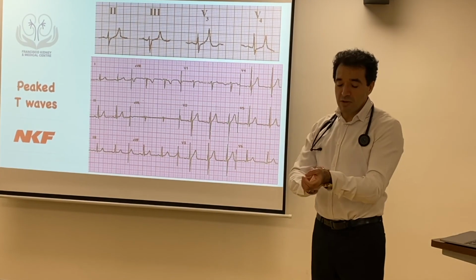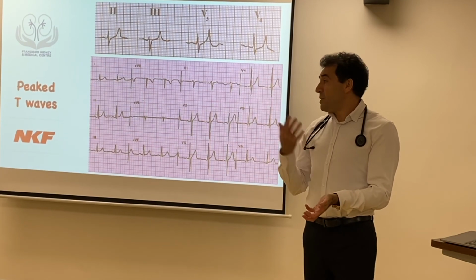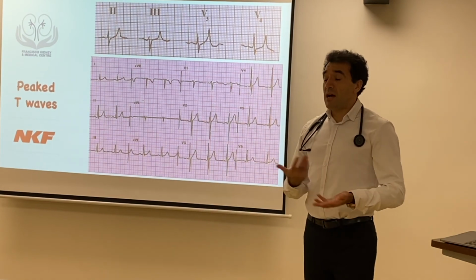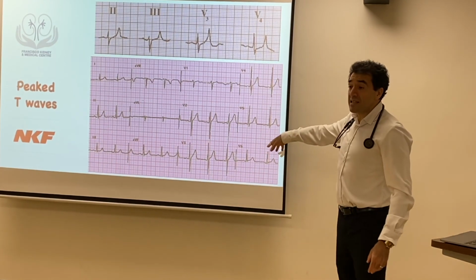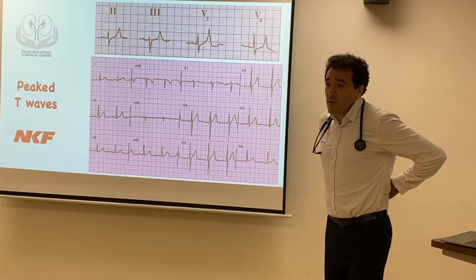So it's like you can measure also the pulse here. And then you can see there are always going to be variations. In a patient that probably has an arrhythmia, the variation can be from 5 minutes to 5 minutes earlier, could be maybe a different rate and different things, no? The patient can sometimes have complexes, later can have runs of tachycardia, yeah, and so you have to see the whole picture.